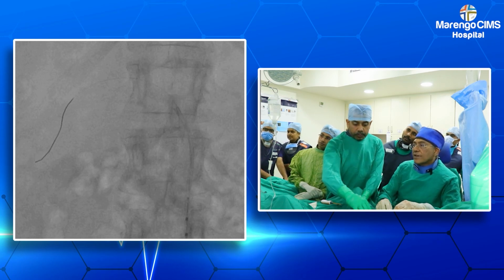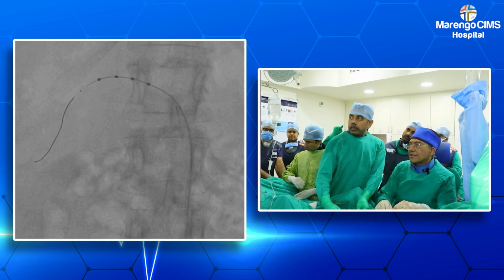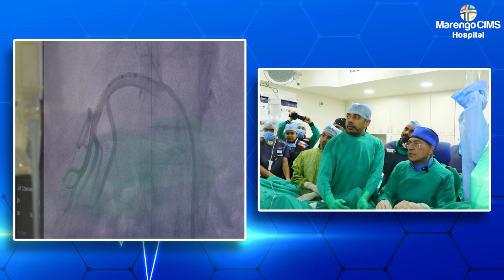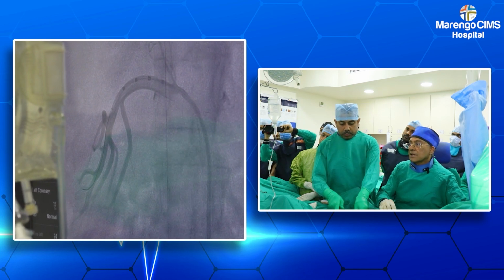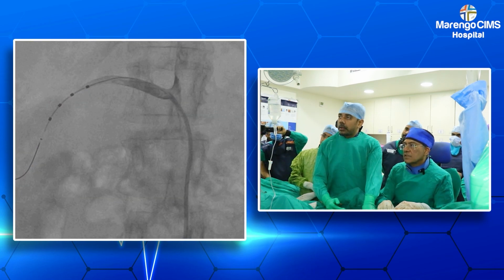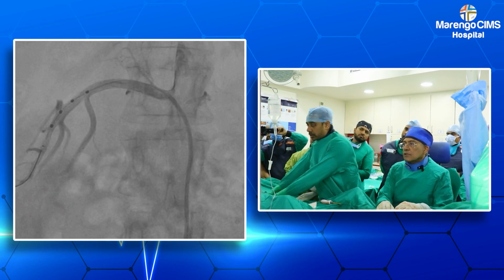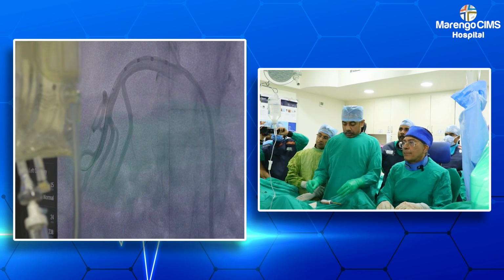So we'll have to ensure that the electrode is outside the cortex, outside the parenchyma. So we'll do a small dye shoot. I'll advance the catheter. We'll go inside. So we'll now assess, each electrode is 5 millimeter apart.